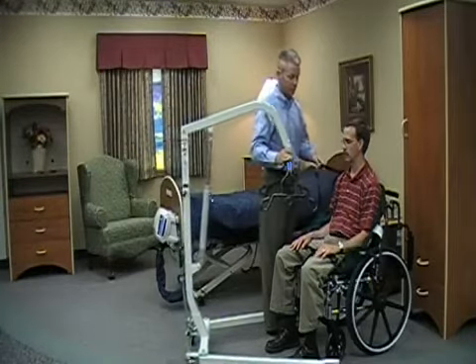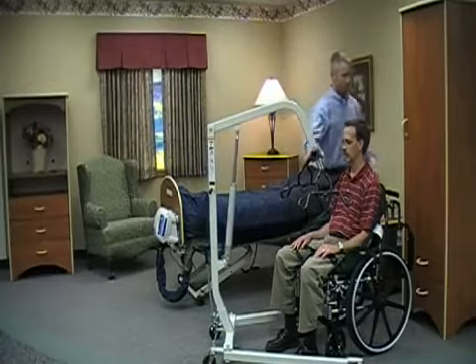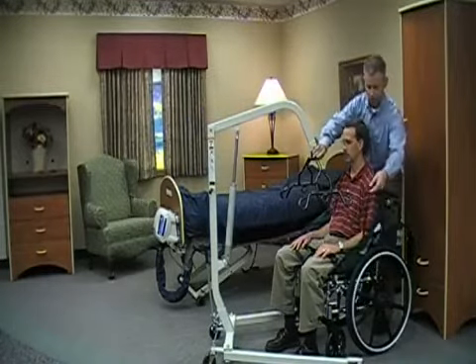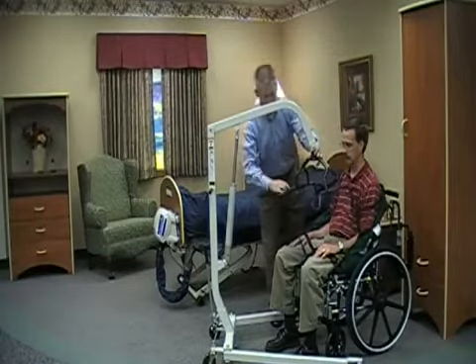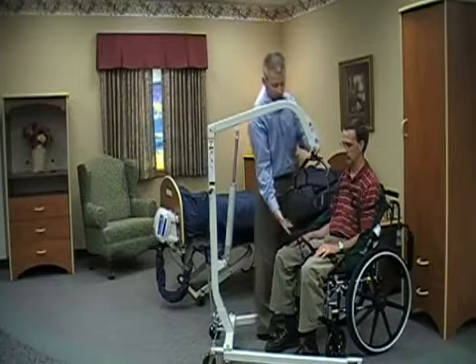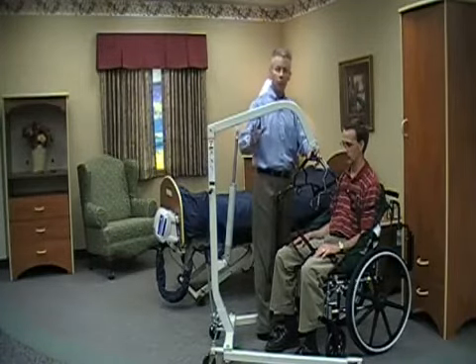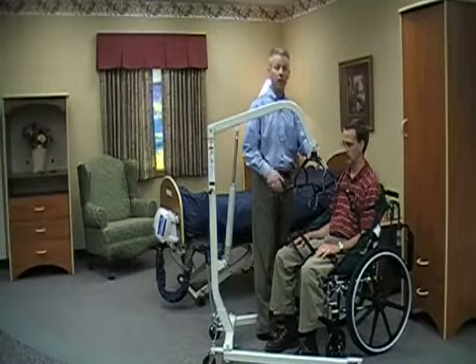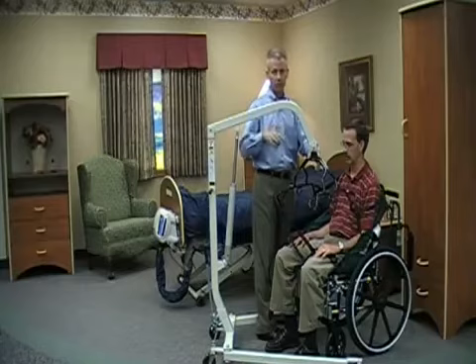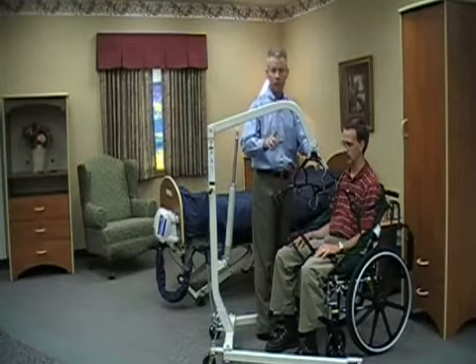So I'm going to use the longer straps on the shoulder and simply make that connection, and likewise on the other side. Then I'm going to proceed with my leg connections. Again, you've got different strap lengths. Depending on how you want to position the resident — if you want them more reclined for transfer to a bed, you can use the longer straps, and if you want them more upright for transfer to a chair, you can use the shorter straps, or in this instance with the legs, you can use the longer straps as well.